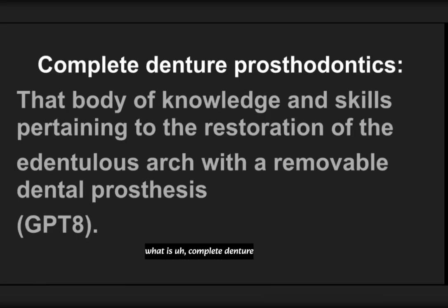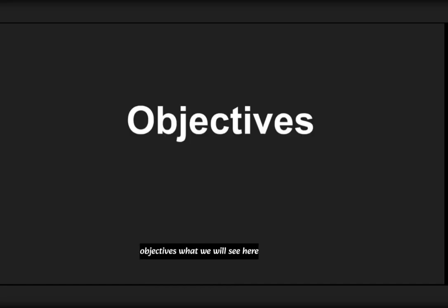So what is complete denture prosthodontics? The body of knowledge and skill to restore the edentulous arch with a removable prosthesis is known as complete denture prosthodontics. Okay, so what are the objectives?